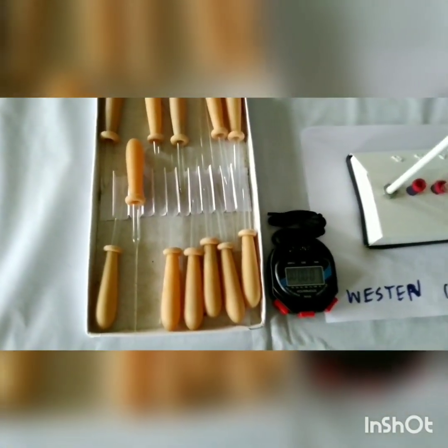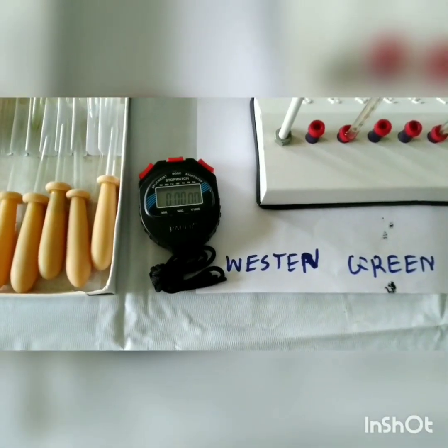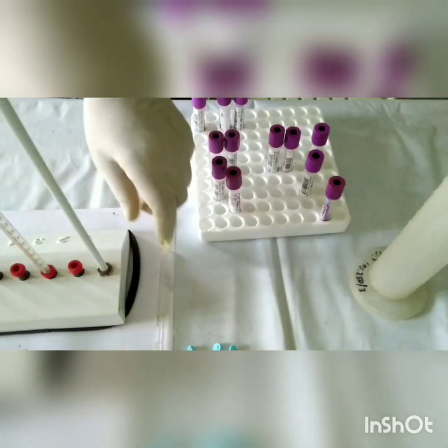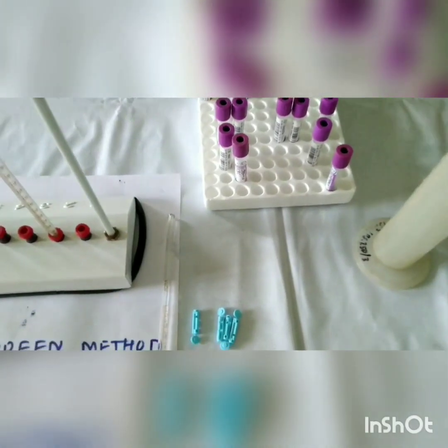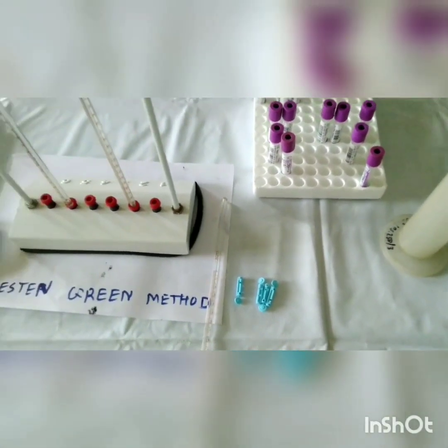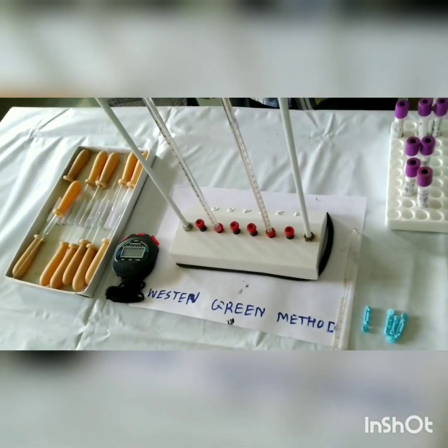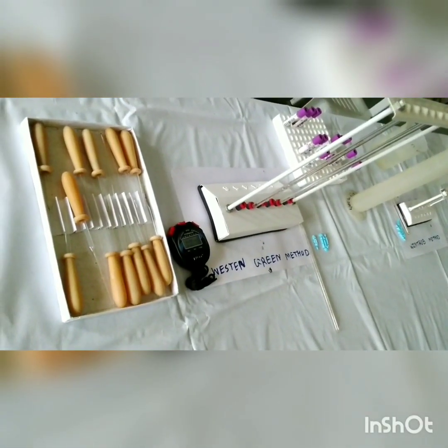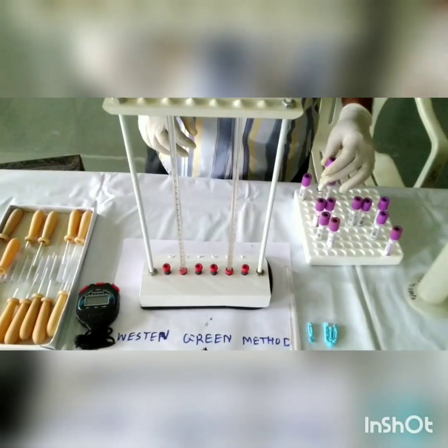Instruments and apparatus required for this method: disposable syringe with needle, sterile cotton swab moistened with 70% alcohol, 3.8% sodium citrate, tourniquet, graduated Westergren tube, ESR stand, and stopwatch.